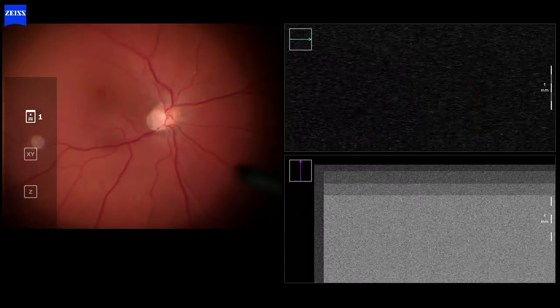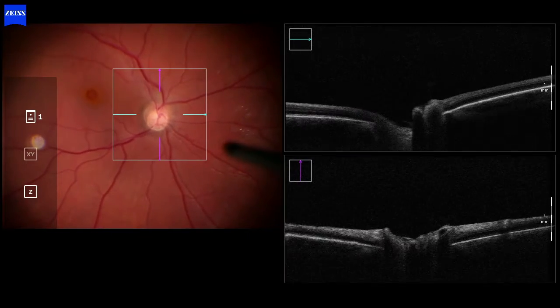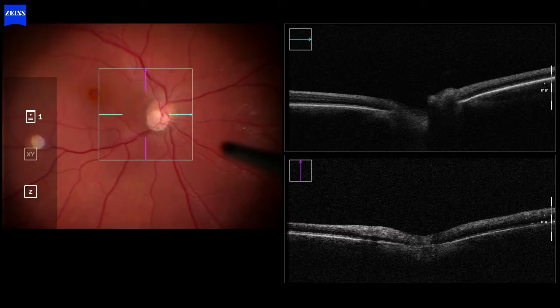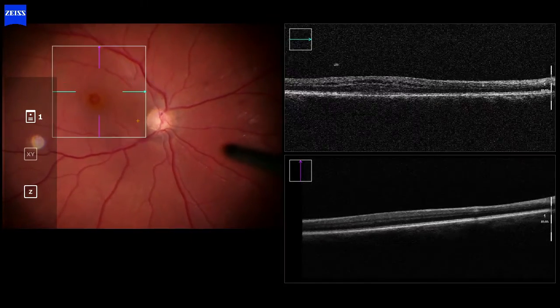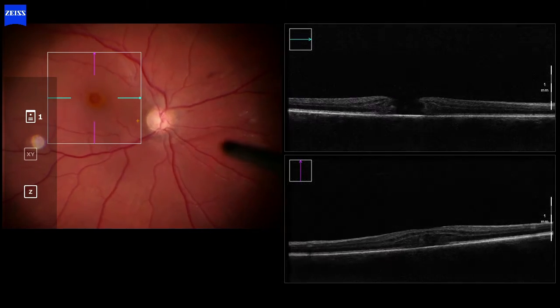Intraoperative OCT allows us to recheck if we can identify any sign of persistent hyaloid adhesion at the optic nerve head. Additionally, in the same maneuver, we can visualize the macular hole with flat edges as initially suspected.